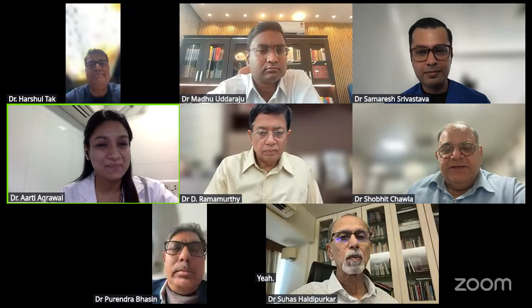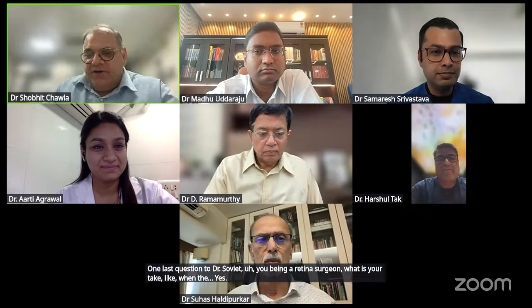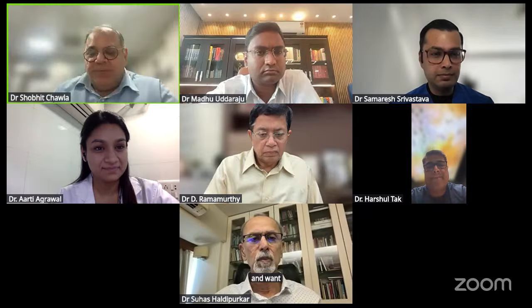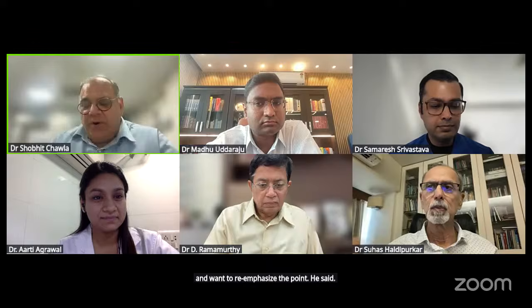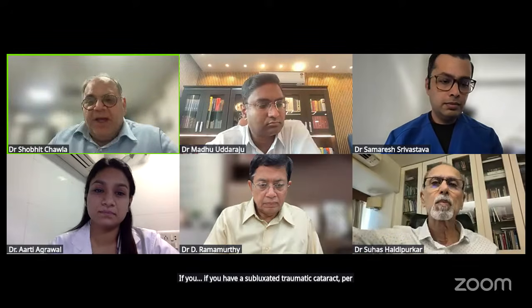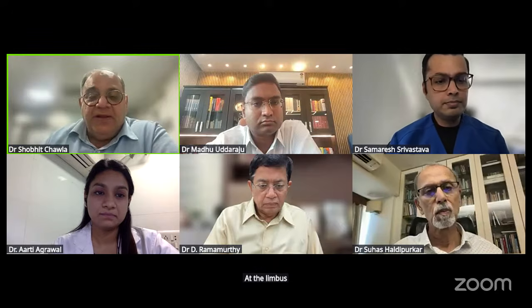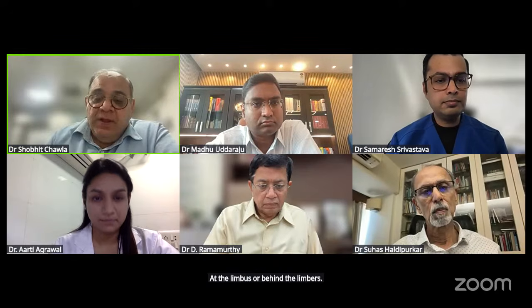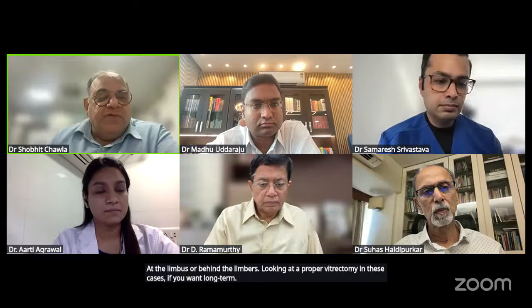Yeah, I just want to congratulate Samaresh on his excellent talk and want to re-emphasize the point he said. If you have a subluxated traumatic cataract, and a perforation in that same eye which has been repaired at the limbus or behind the limbus, a proper vitrectomy in these cases is a must if you want a long-term good prognosis for these eyes.